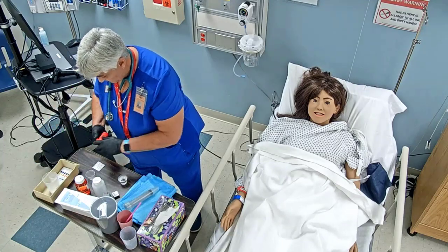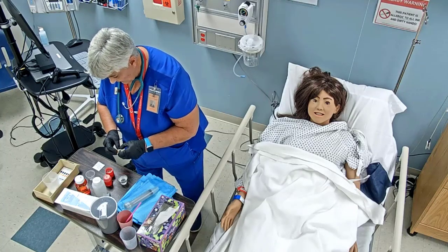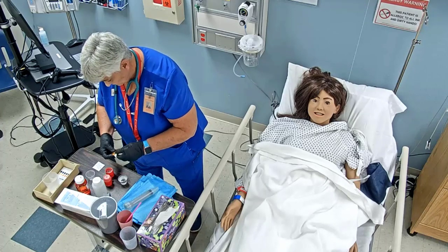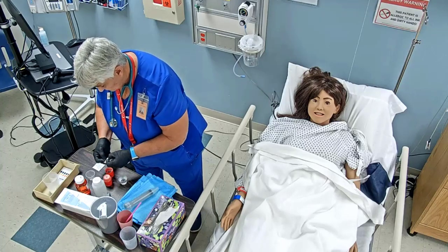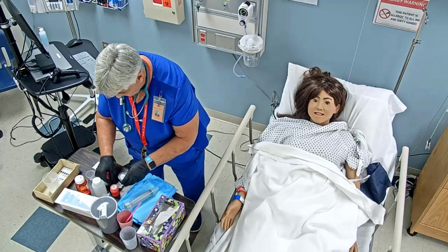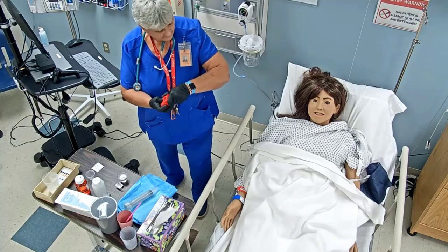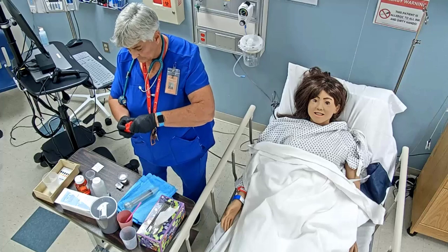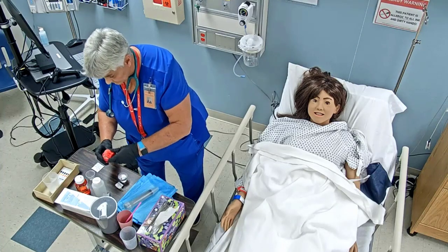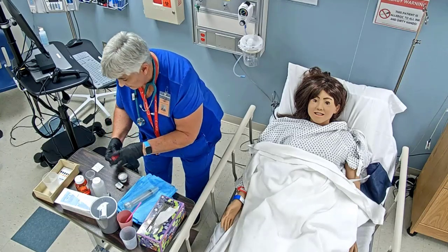Okay, so I'm going to get my pill crusher, and this was washed from the one time before, and this is our metoprolol. It is a crushable medication. I want to make sure that I keep my medication with the one that I'm going to be using. We're going to get that mixed up in there good. And this was mixed with 30 mils of the sterile water.